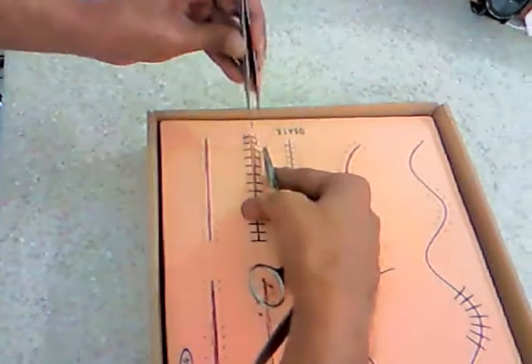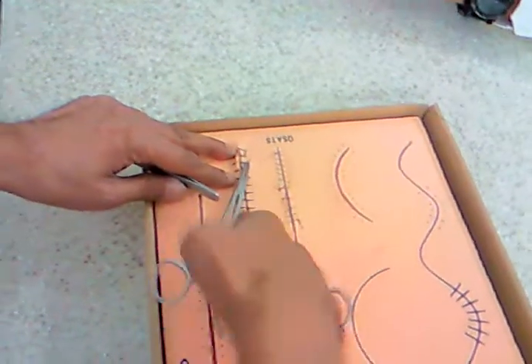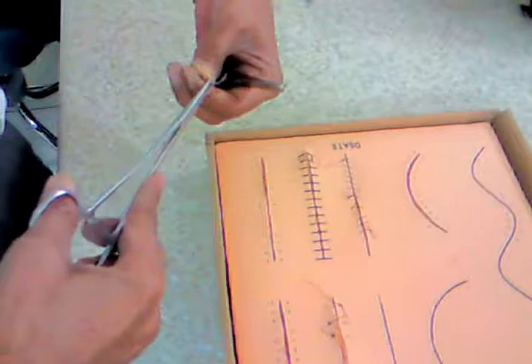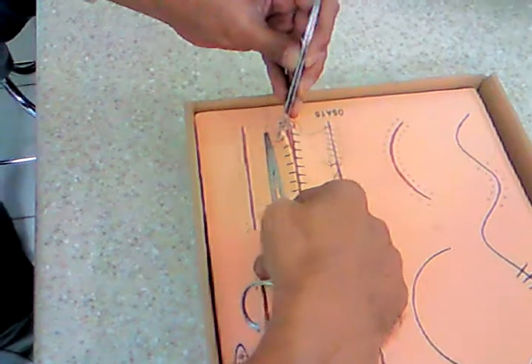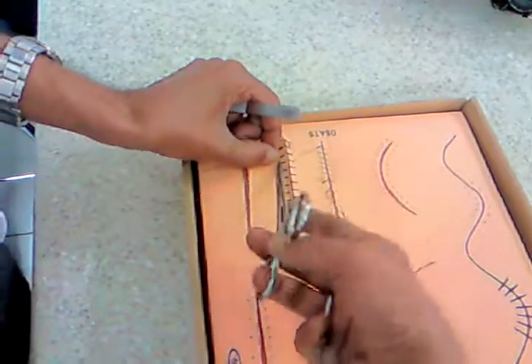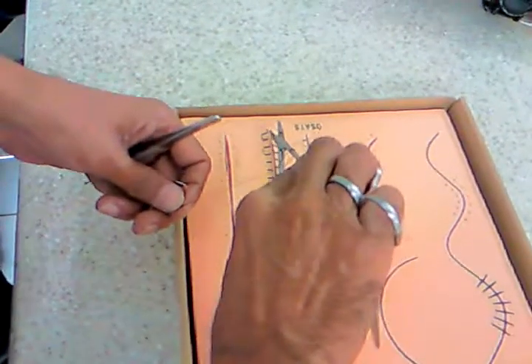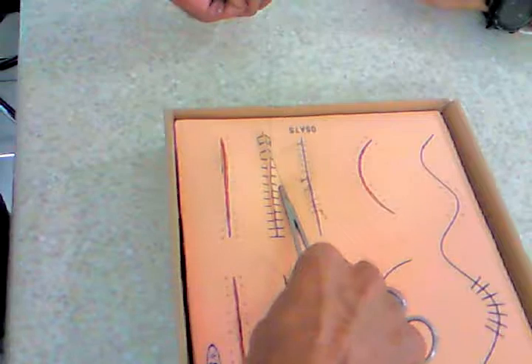Okay, one more. So again, the usual way. Okay. Now, same side, full thickness. No, this is what you wanted, isn't it? Tooth loops. I did it for you. Tied it up. So you can see the edges are getting everted.